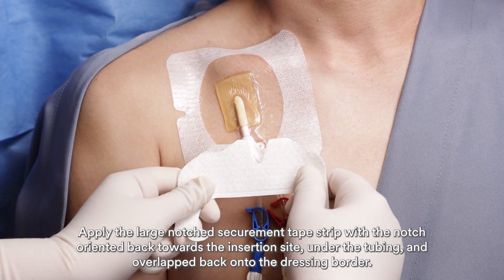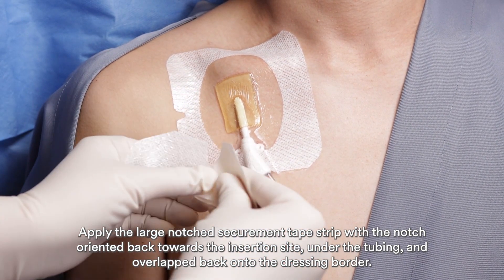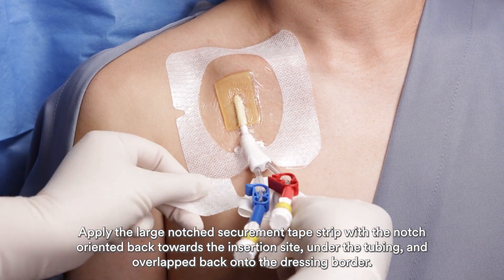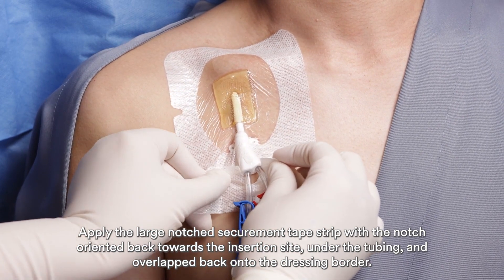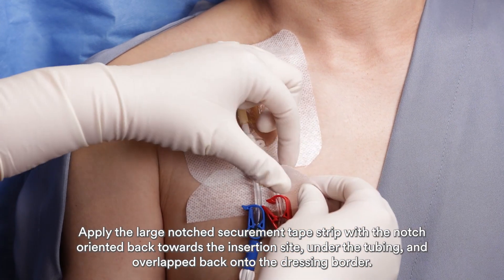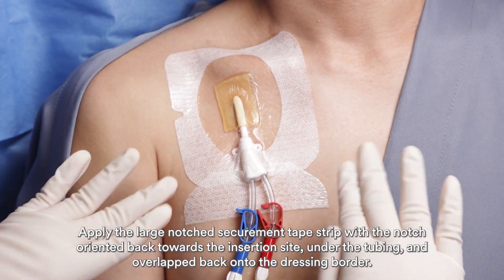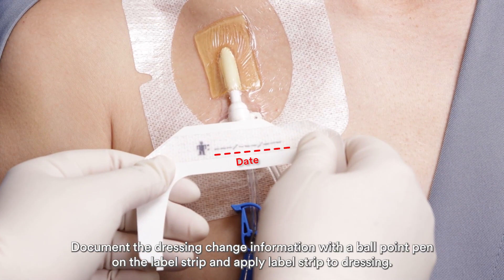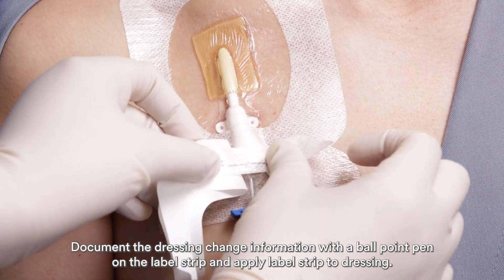Apply the large notch securement tape strip with the notch oriented back towards the insertion site, under the tubing and overlapped back onto the dressing border. Document the dressing change information with a ballpoint pen on the label strip and apply the label strip to the dressing.